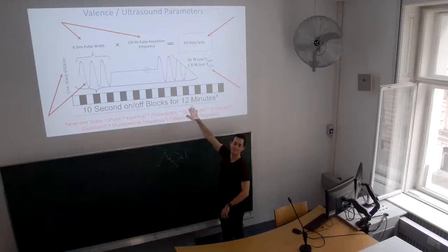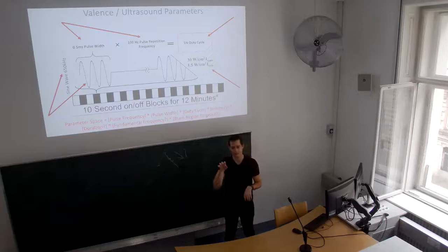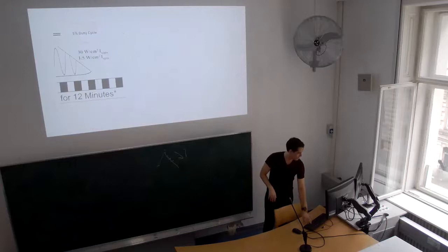So even on top of that, you can turn it on for 20 seconds or 30 seconds and then off. This is what I do. I do 30 seconds on and off in the MRI for a block design, so I can look at the changes on and off. That's a common thing I've done in the MRI. The initial thought also was that it might be a little safer because it gives some time for everything to relax or heat to dissipate. But we know now that it doesn't matter. It's fine. You could turn it on for 5 minutes or 10 minutes. It's fine.